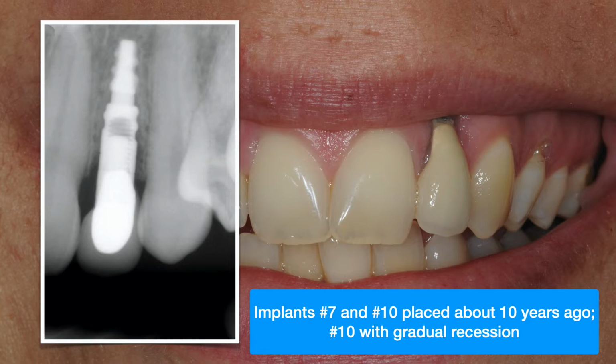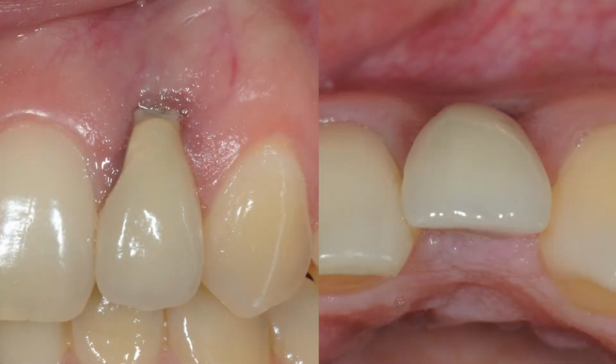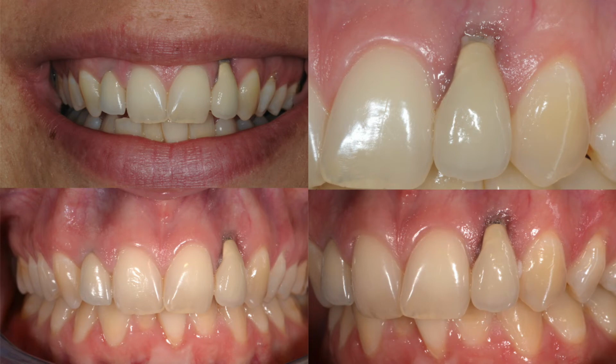Implant, restoration, abutment. This was placed in Europe, so I'm not really sure of the type of the implant, a different brand and brand name. You can see the over-contoured restoration, which we'll see in a sec, and there's actually food impaction along the gingival margin, which contributes to the gingival recession. But her major chief complaint was, I don't like my smile. And that's pretty much her smile.